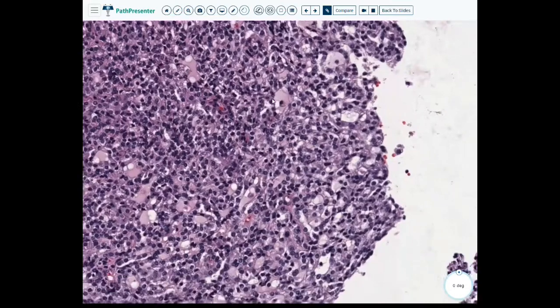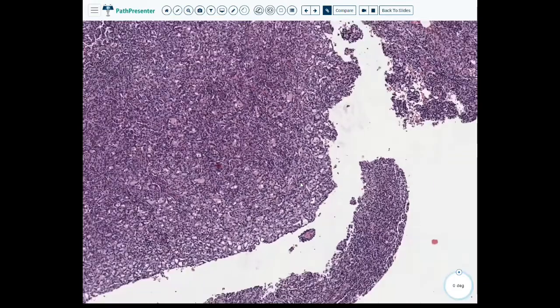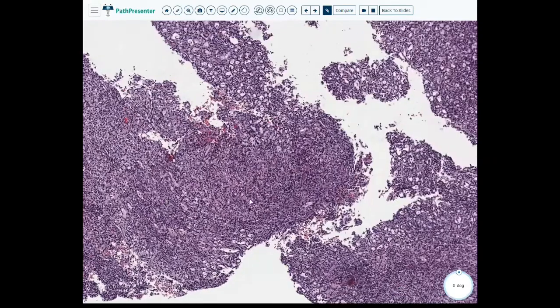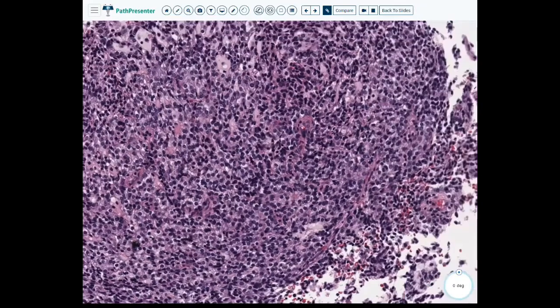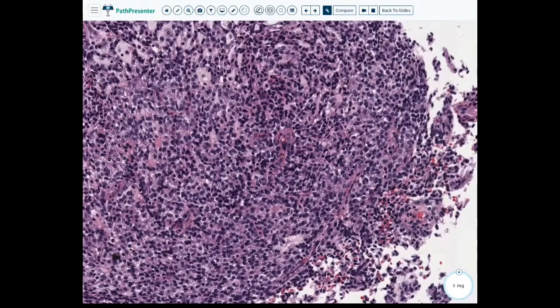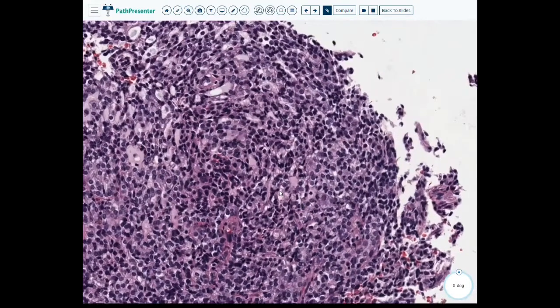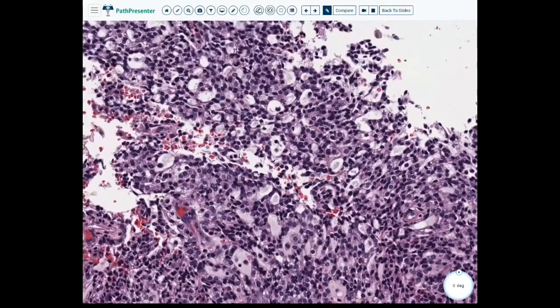Even though we didn't go over these things, if you were thinking about, okay, is this maybe like the epithelial portion of a Wilms tumor, where it kind of looks like you have these small round blue cells, I think there's far too much cytoplasm for that. Again, I'm not thinking that this is some variant of clear cell.